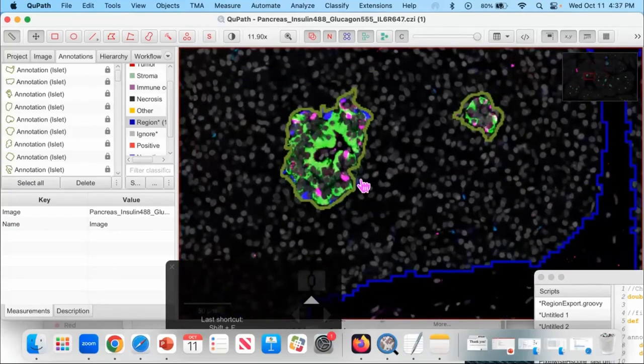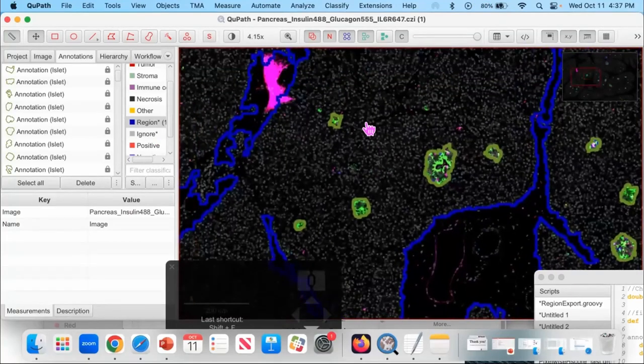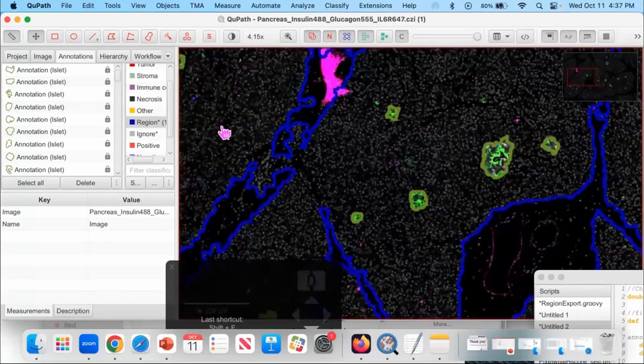This was from a type 1 diabetes study. One of the things that happens in type 1 diabetes is the islets get invaded by CD45 cells. At the very beginning of disease, you see just a ring of CD45 cells around the islet that are trying to penetrate it and are about to. So a really common thing we do in type 1 diabetes studies is to look at, say, 20 microns around every islet and see what's going on there. In this particular case, we haven't labeled CD45, but whatever. This is called the peri-islet region, and it is a big deal in the T1D literature.